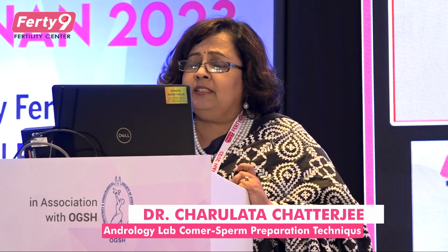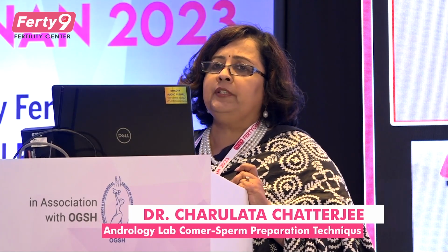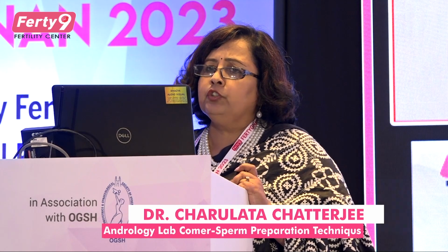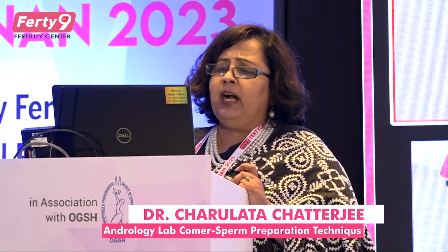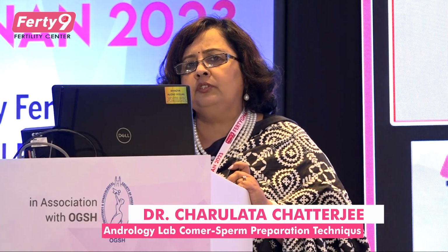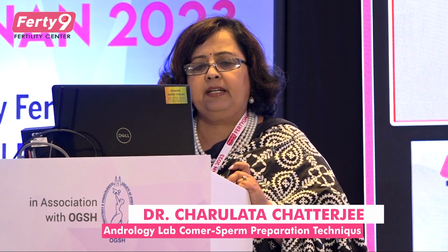There is much evidence which says that they have checked the semen sample for DNA fragmentation, and after the preparation they have checked the sperm DNA after MACS, and it is becoming less. That way we can have the confidence that the sperm is good and we can use it for either insemination or ICSI. So these are the literature which says that MACS preparation can avoid DNA fragmentation and can be used as one of the advanced techniques to prepare sperm in the ART laboratory.